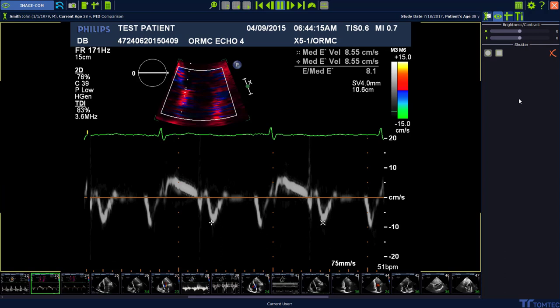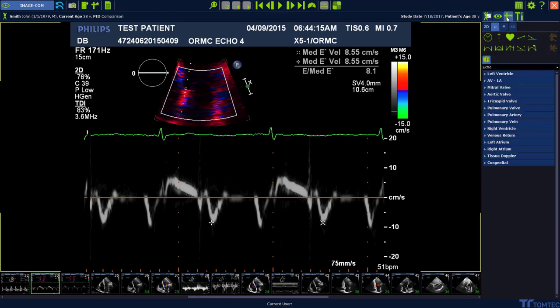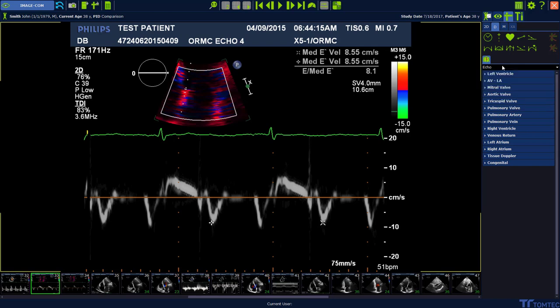To measure tissue measurements, go up to the measurement tab on the top. Select the exam type echo, followed by the package tissue doppler.